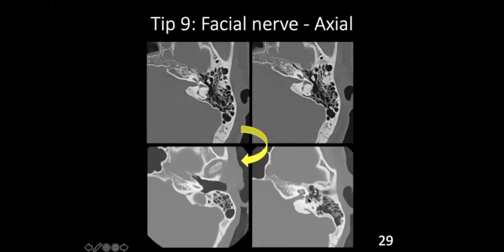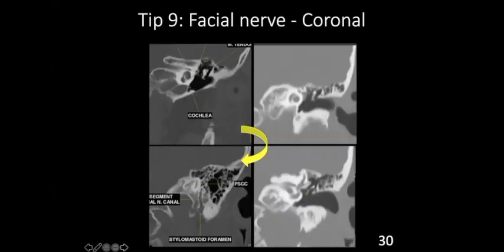To identify the second genu and vertical part, look at the cochlea and the vestibule. Here you can see the oval window and the stapes. Look posteriorly and lateral to the vestibule — there will be a space there, which is the sinus tympani. At a lower level, we can see the jugular bulb, and lateral to it, the facial nerve running downwards. At that same level, the last basal turn of the cochlea will also be seen.